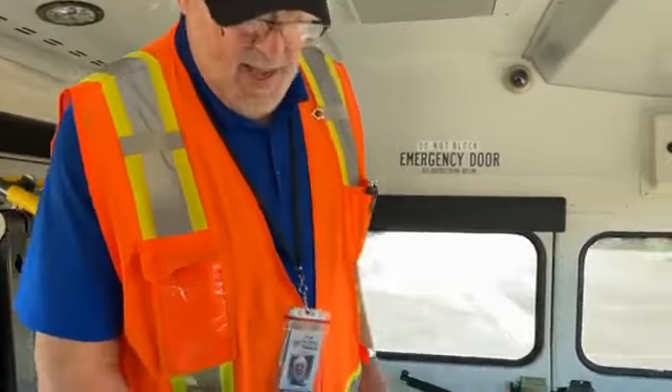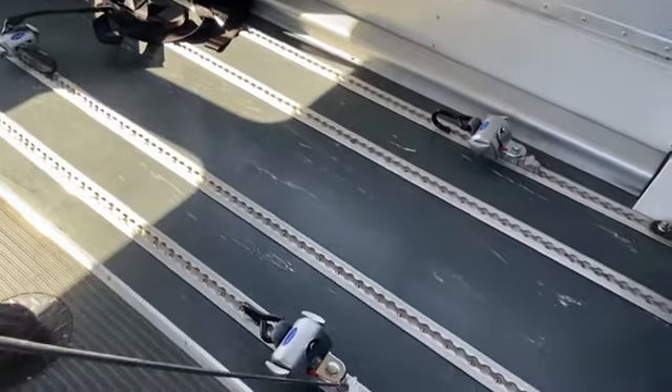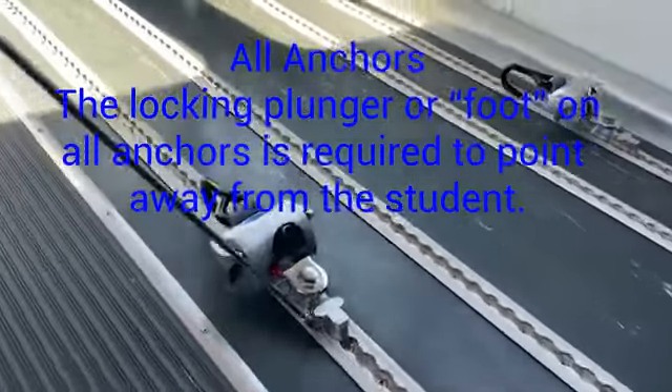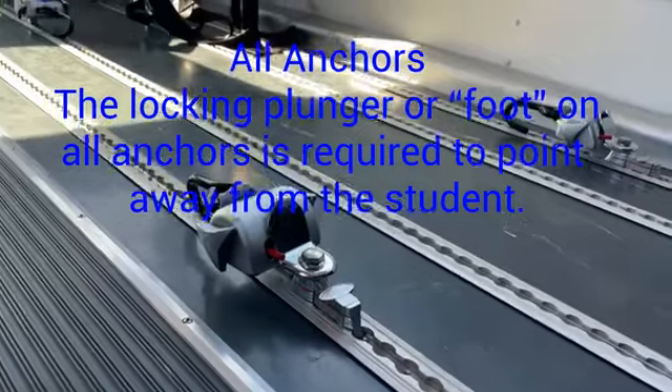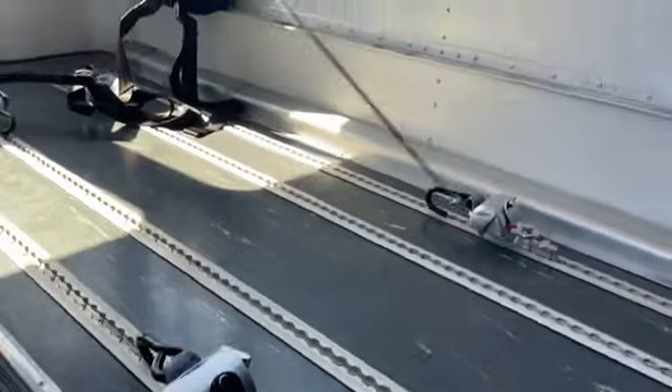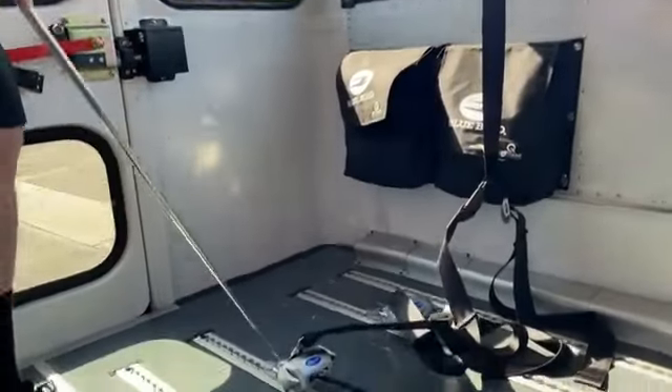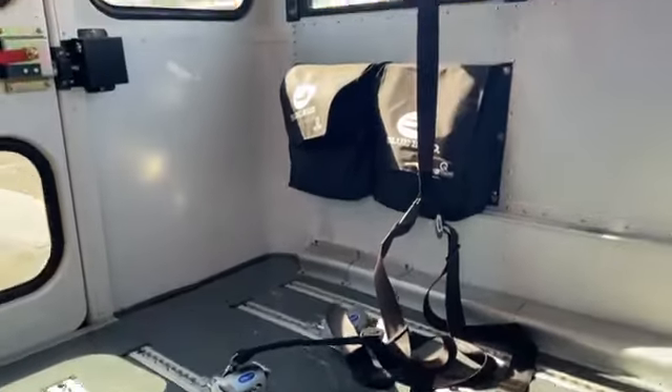This video is going to cover just the technical aspects of loading and unloading a wheelchair. When you look at the wheelchair, the anchors have to have this part right here — some companies call it a plunger, a locking plunger, some companies call it a foot. This part has to be placed on all anchors, and it has to be placed away from the student. You can see over here it's away from the student, back here it's away from the student, and here it's away from the student. It's important because if even one of the anchors has the orientation turned around facing toward the student, you void the manufacturer's product liability warranty.